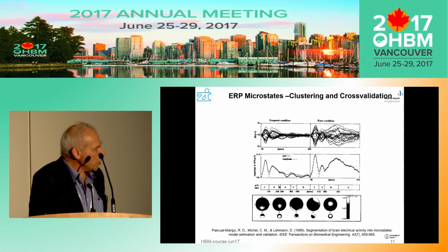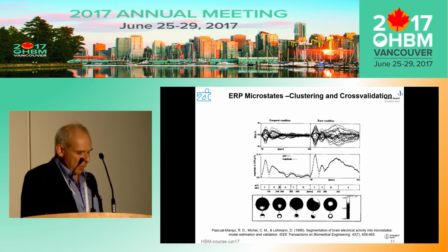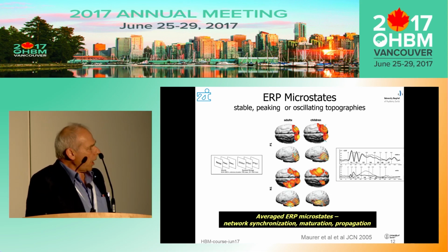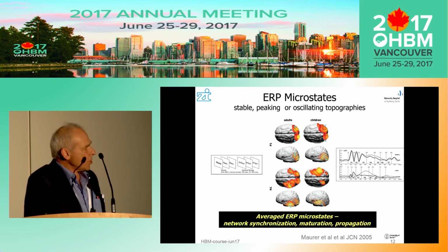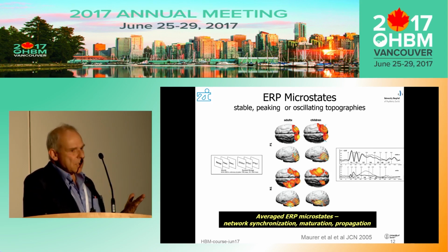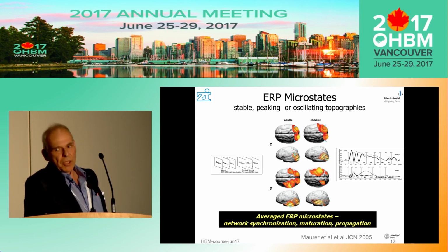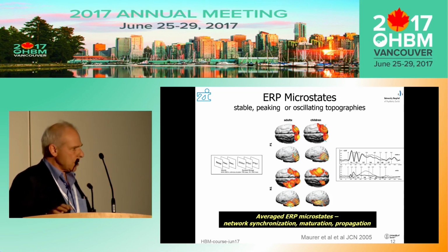This is another approach, a clustering approach, which was developed quite early. I think what is striking, and what always strikes me, is that really there is lots of activity that shows that concurrent parallel activation in sync in the brain due to stimulation, due to information processing is very prominent, and that also holds for anterior and posterior activation patterns.